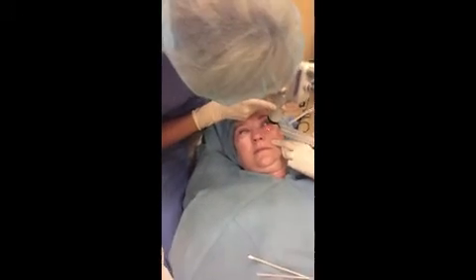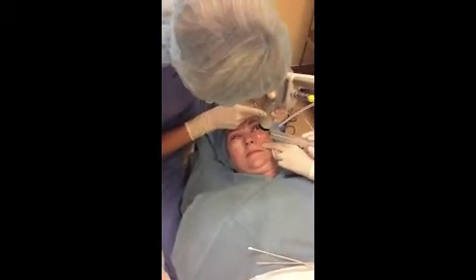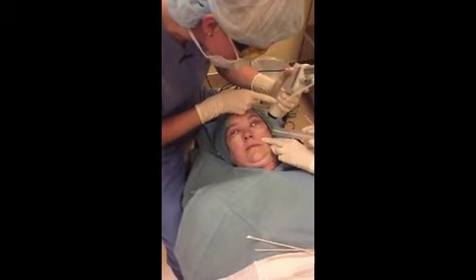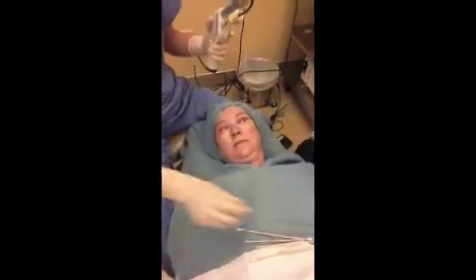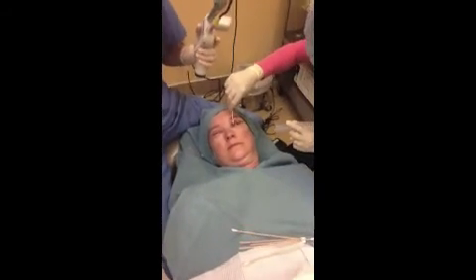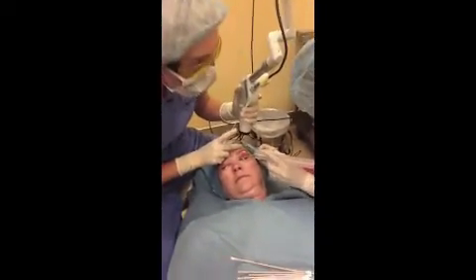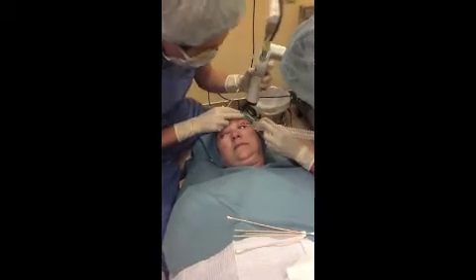Make it a little spicy right here. And if it goes out of focus, you just touch it and it will refocus — and it will slice it. Good job. And now just relax. You got it. So just hold it there and just wrap it here. Keep her in the center of the screen. And just touch that and it will kind of refocus.